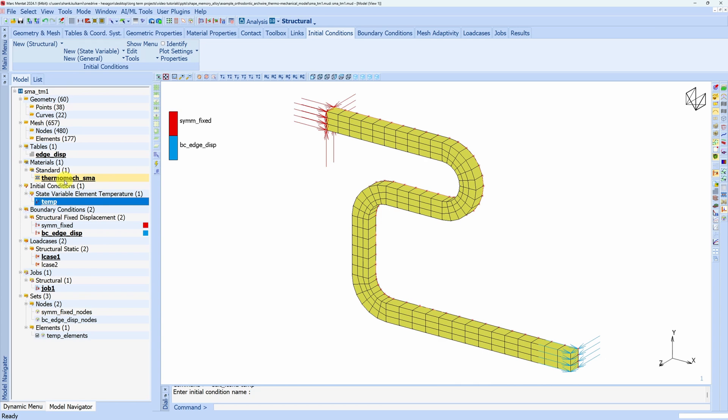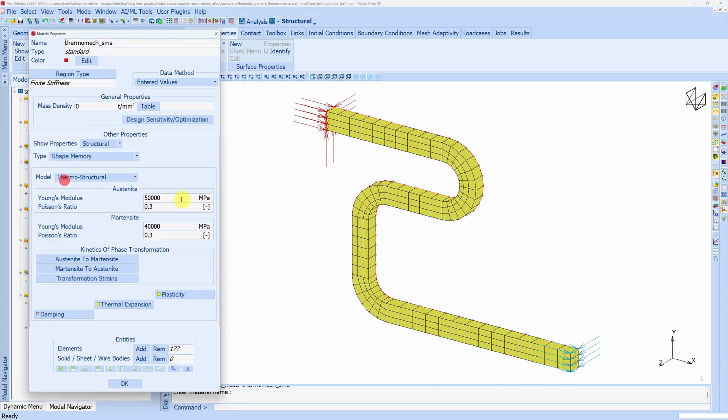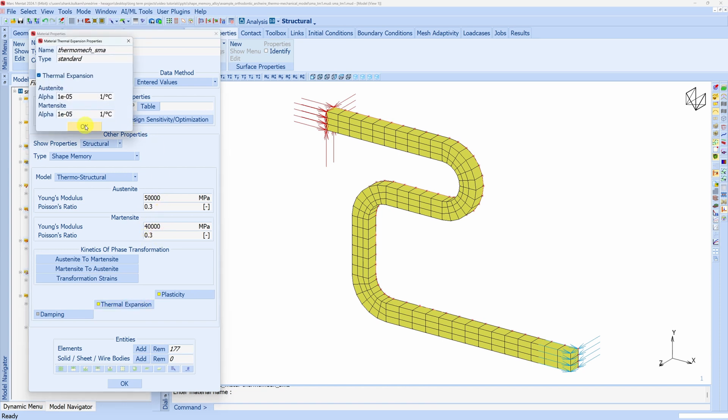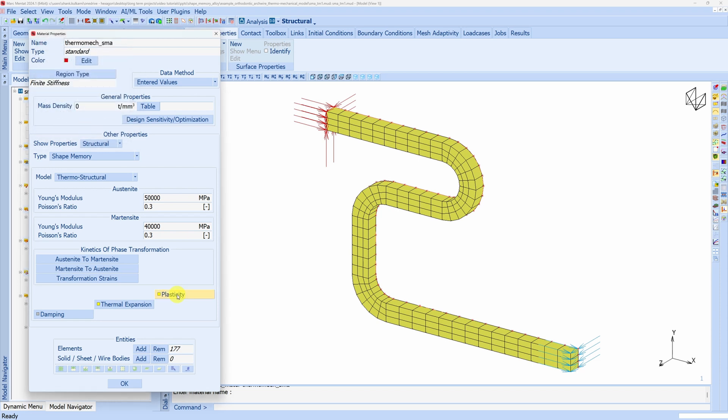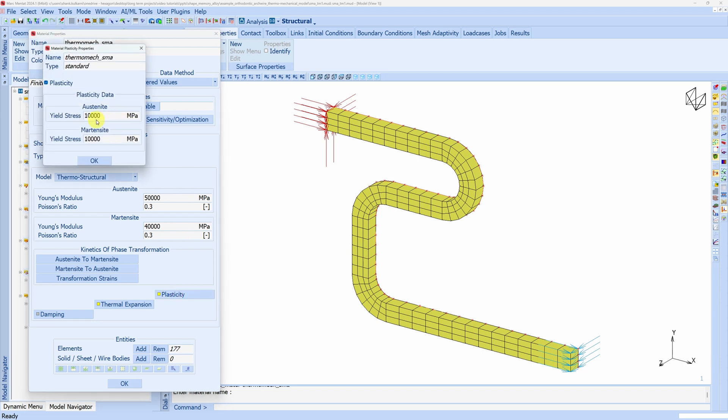Next let's see the material card. We are using a thermostructural model. Elastic properties of austenite and martensite are provided here. We have thermal coefficient of expansion as well, but in this example temperature is not changing, so this is not going to play any part. We have plasticity defined over here.